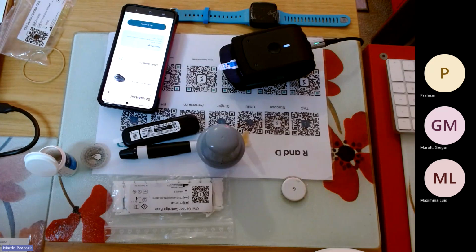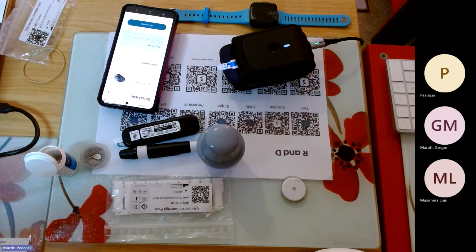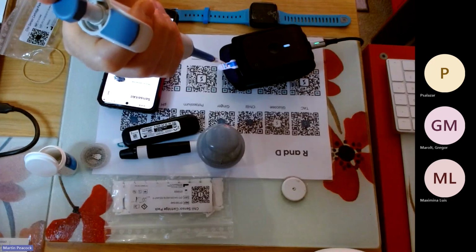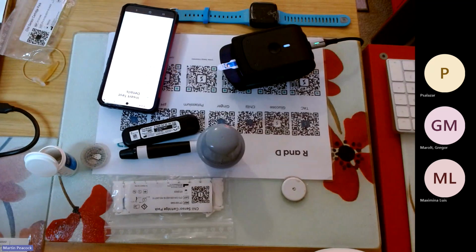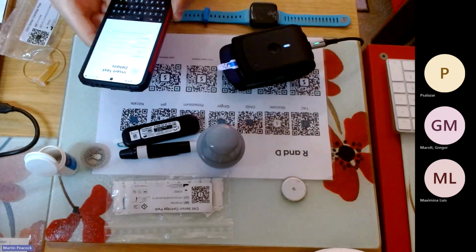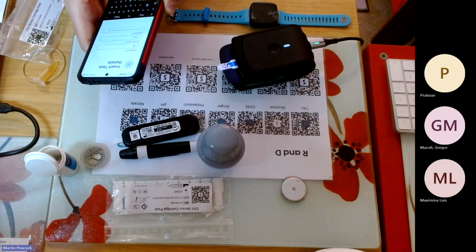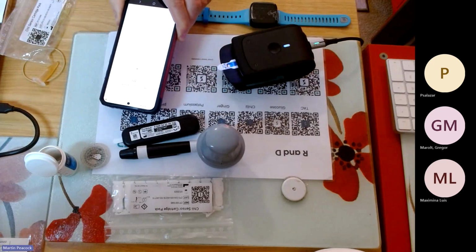The beautiful thing about electrochemistry is we don't need much sample. In fact, I was talking to somebody and they said, oh yeah, we put 100 microliters on. I was like, wow, 100 microliters, come on, it only takes 50. Just out of interest, a glucose strip can operate on 300 nanoliters of sample. I put the sample on like that. I'm just going to give the sample a name, because I want to find it later on. Test one, done. Go to assay, start measurement.